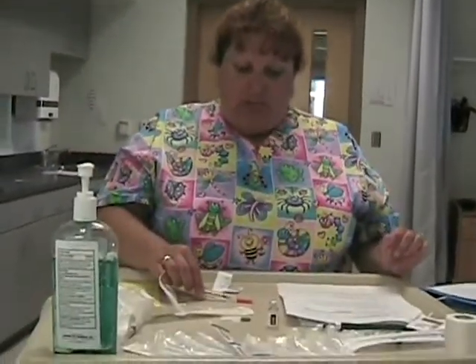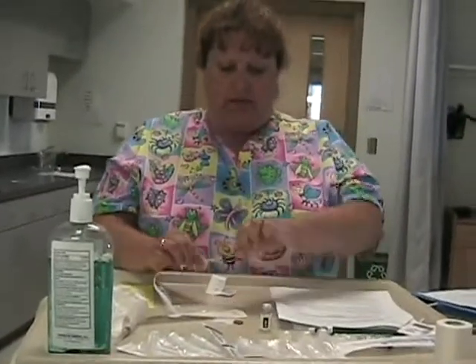It is dry, so we go ahead, take our syringe, we put it in, holding the vial, plunging the air in, and turning over your insulin. Go ahead and draw it up past the 10 to eliminate the bubbles. Do not tap, because with tapping insulin, you go ahead and break up the molecules. 10 units. Then you want to do the scoop mechanism. Once you have it covered, go ahead and cap. Also, most facilities now are doing insulin as a dual nurse check.